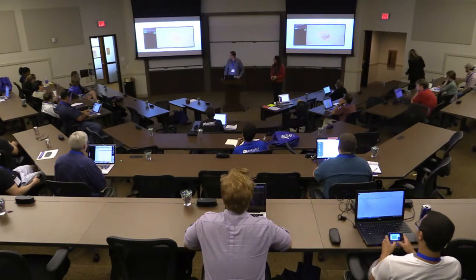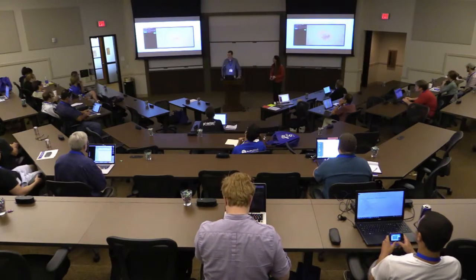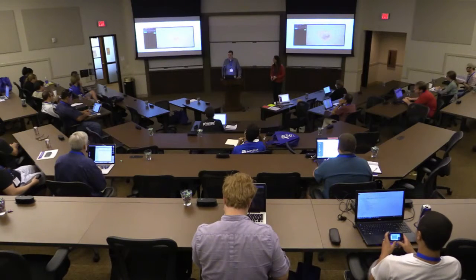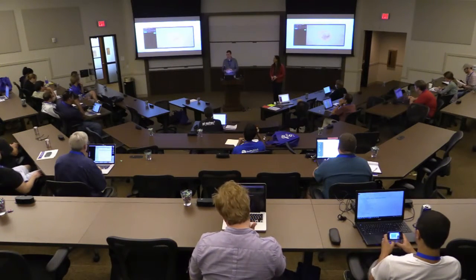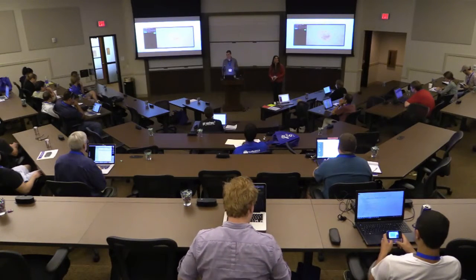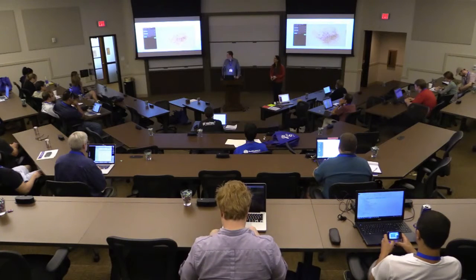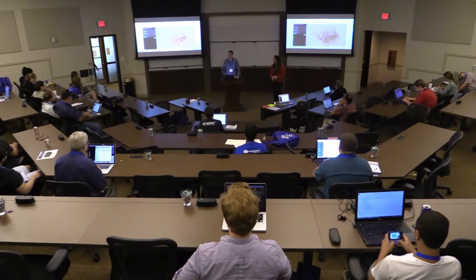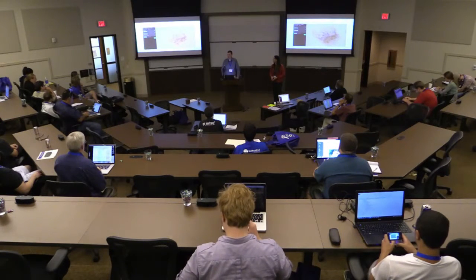So particularly for detecting the lesion, the process is you click a point and you select a tolerance, and then the boundary is generated automatically. And then the user may iteratively adjust the tolerance, which will basically concentrically expand outwards or inwards until they find that they have actually identified the edge of the lesion. And the same thing for the superpixel step. You're able to modify the tolerance until you find a value that you believe has some homogeneous regions.